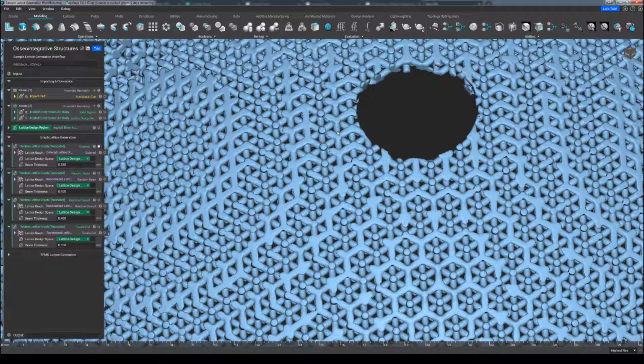This truncated representation that we see on the screen is really just for digital representation of your lattice. If you prefer to digitally see these beams not truncated and rounded instead, there is a thickening block inside of the structure generation folder that can give you rounded beams. Ultimately, this roundness or this truncation will pass on to your STL. There are some slight nuances between these digital lattice results, so please read the PDF documentation to find out more.